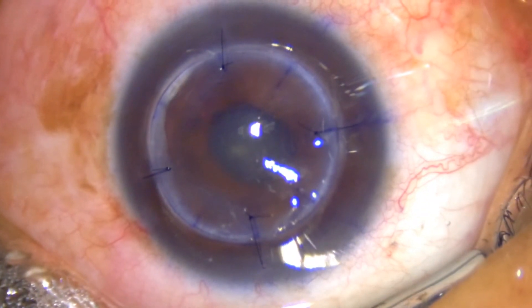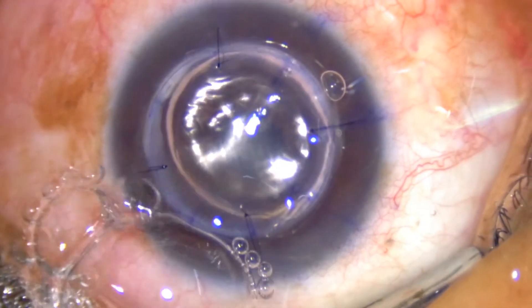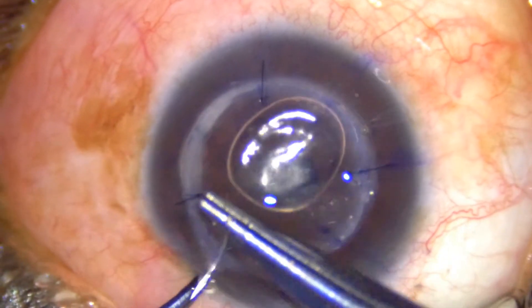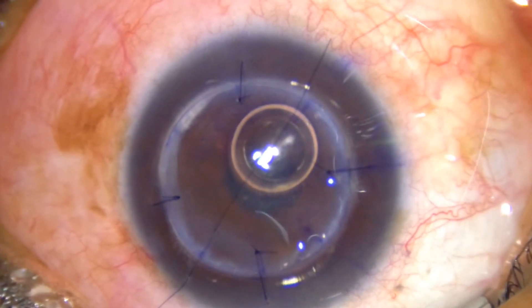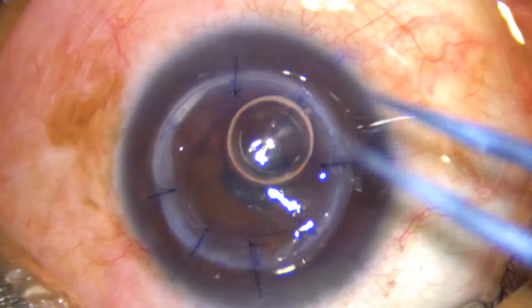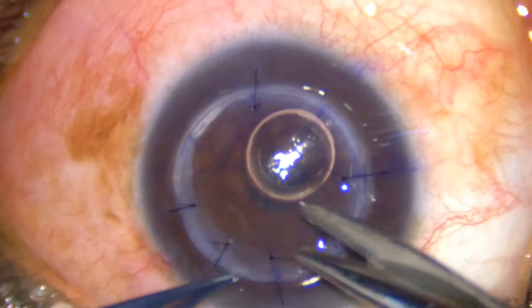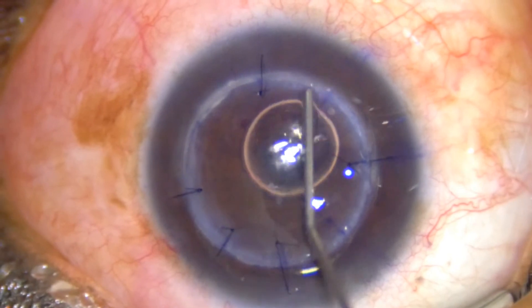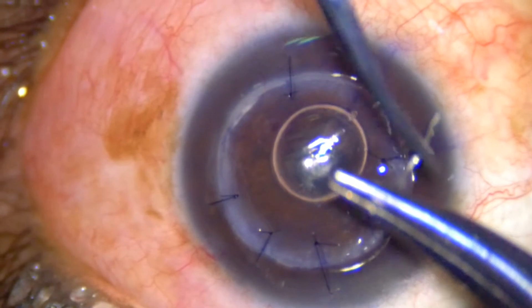In between sutures I usually keep reforming the anterior chamber with BSS, which helps me to take sutures with good tension and proper orientation. Try to take the sutures as perpendicular as possible to the graft-host junction. Follow the rule that you always tie diagonally opposite sutures first — that is first 12 o'clock, 6 o'clock, 3 o'clock, 9 o'clock — then intermittent sutures.